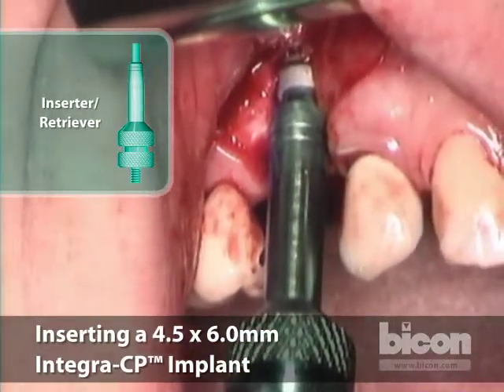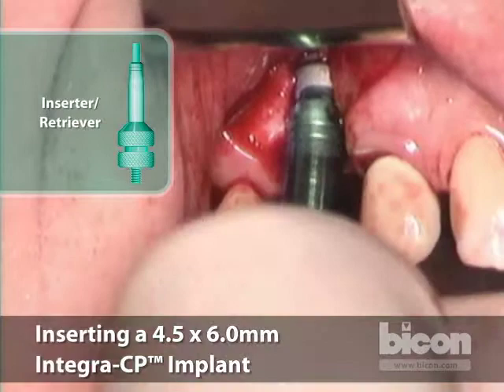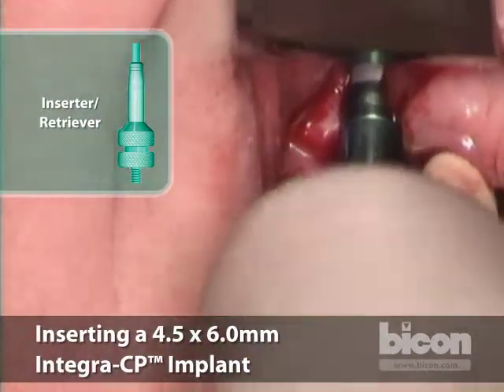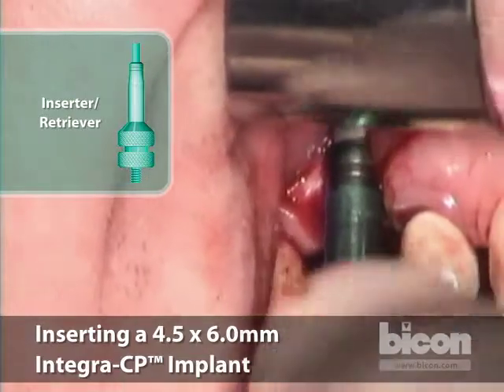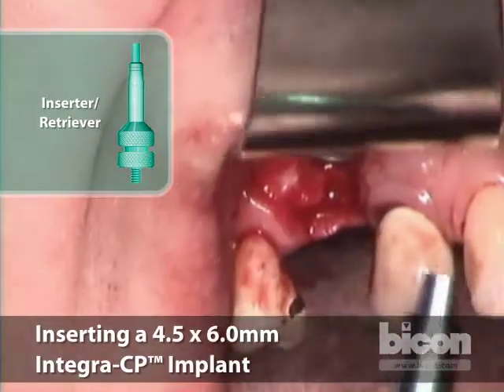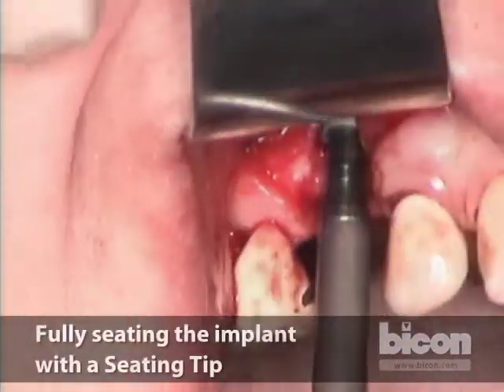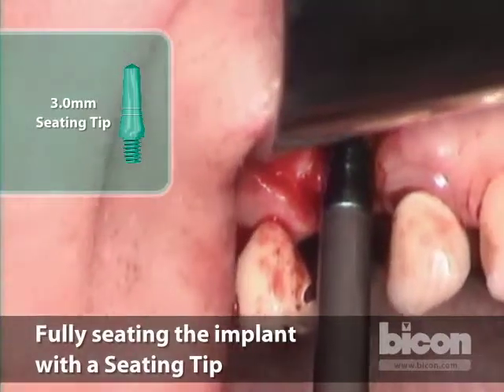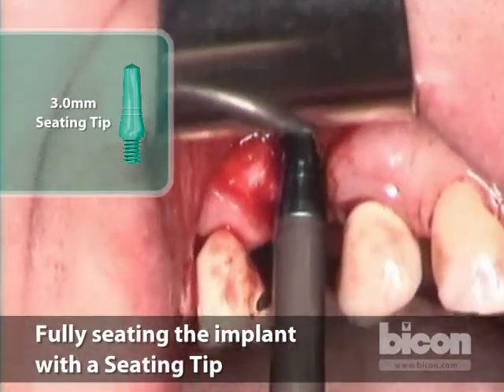Okay, hold this please. Then by twisting the knob that's closest to the implant counterclockwise, it disengages the locking taper, freeing the post of the inserted retriever, allowing us to leave the implant behind. Now we'll take an inserting or a seating tip and fully seat the implant in there. A little tap.